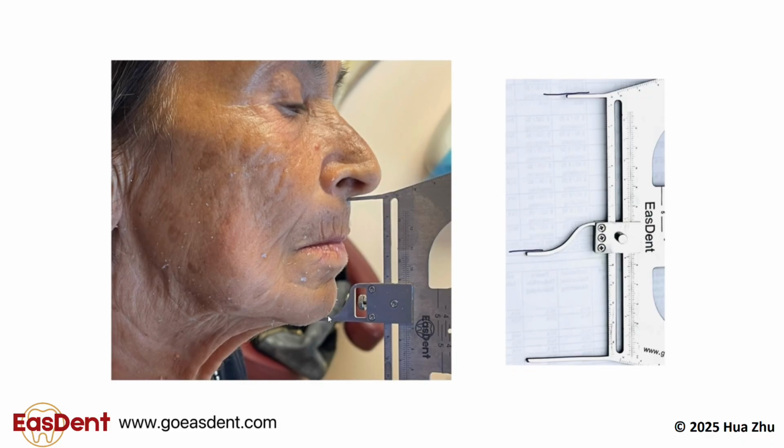The width of the movable stick is 2 mm. Therefore, the bite position is 2 mm less than the preset VDO. This 2 mm room is left for the thickness of the final impression material.